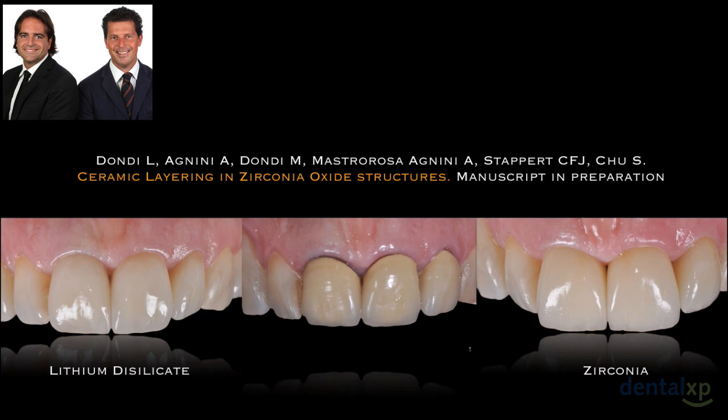The results of this article are based also on the perception of the patient, evaluated through an online survey, and also through a spectrophotometer analysis that has been done especially on the white and pink interfaces, both of the zirconia crowns and the lithium disilicate crowns.